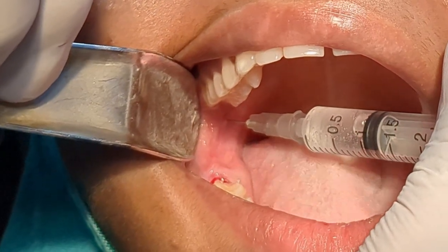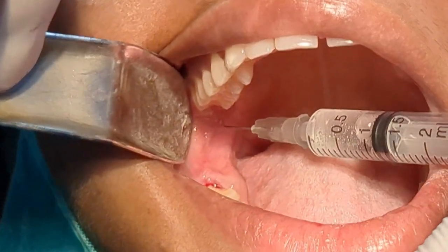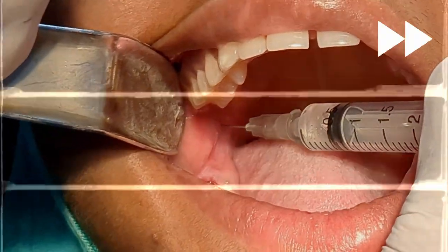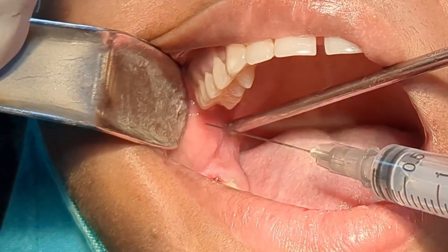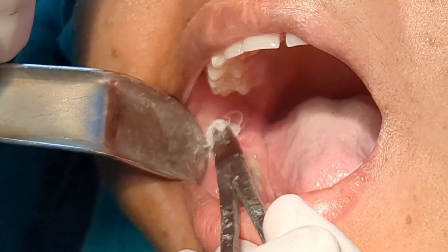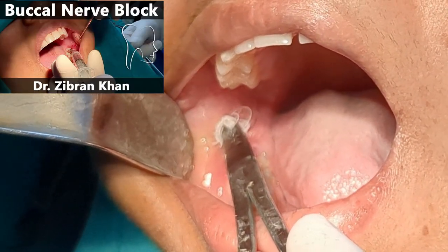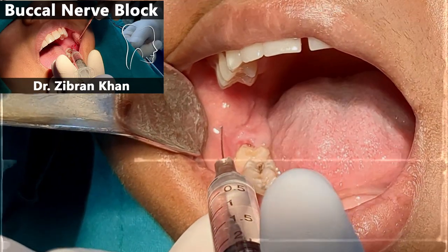For the lingual nerve block, I withdraw half the needle, aspirate in two planes, and deposit the LA solution. I do the same thing for the buccal nerve block. You can watch my video on buccal nerve block for further explanation.